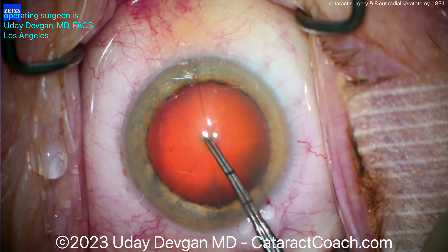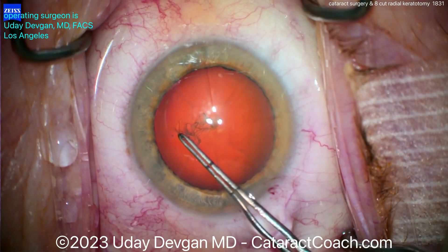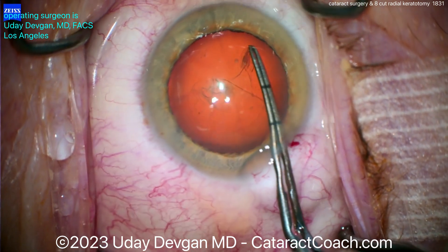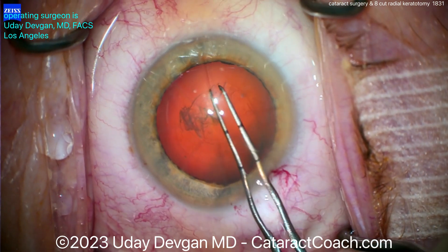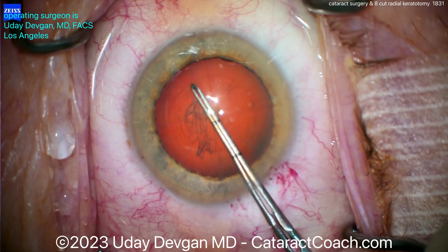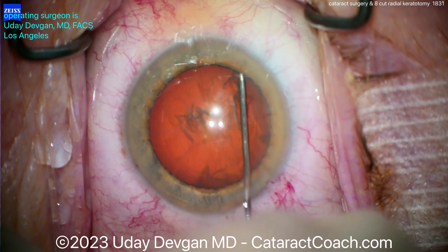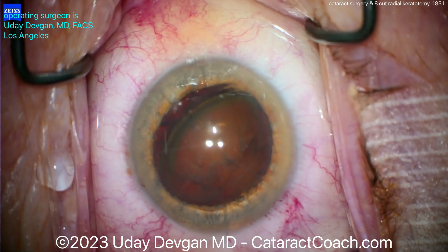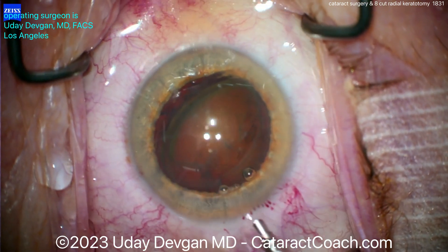We're getting a 5-millimeter rhexis done. Let's talk about the lens calculations. In these eyes, the calcs can throw you off. RK changes both the anterior curvature and the posterior curvature of the cornea — that's different from LASIK or PRK, which only change the anterior curvature. You have to take that into account. When you measure the cornea, machines will read it as stronger than it is — it may say 35 diopters when the true power is only 33. Using the incorrect value leaves the patient hyperopic. I have detailed explanations on CataractCoach.com on how to do the lens calculations correctly.